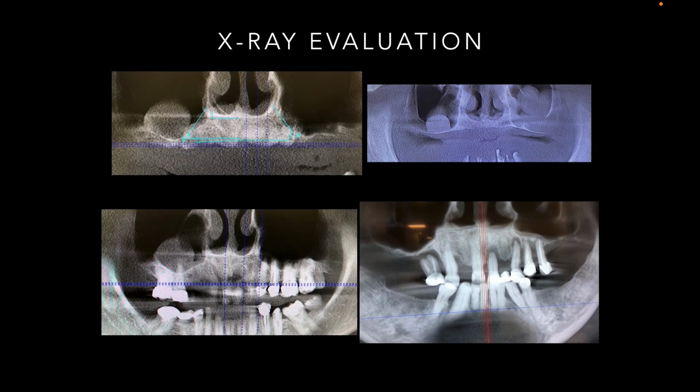Let's look at, again, these are more of a panorex kind of visual of these. I want to look at some of these. Look at these pneumatized sinuses in some situations. You can see maxillas very edentulous on the top, very atrophic, minimal crestal bone in the molar premolar region. The lower cases are dentate patients, but very pneumatized sinus or infection in areas where you cannot place an angled implant going anteriorly in the premolar region.